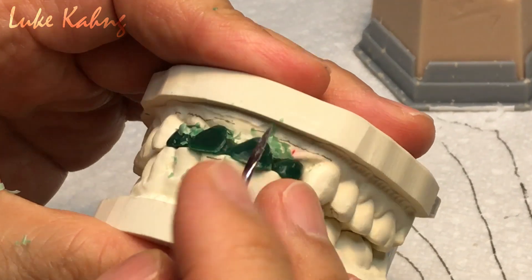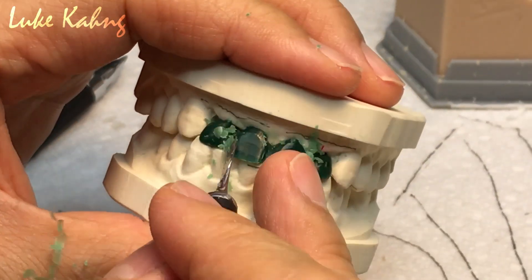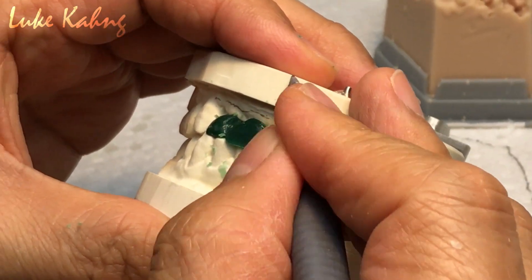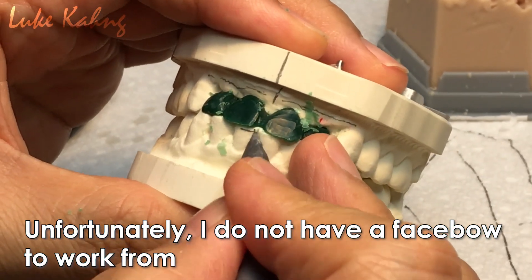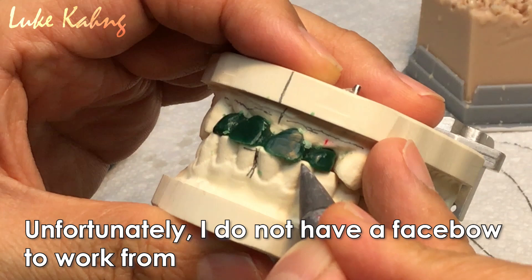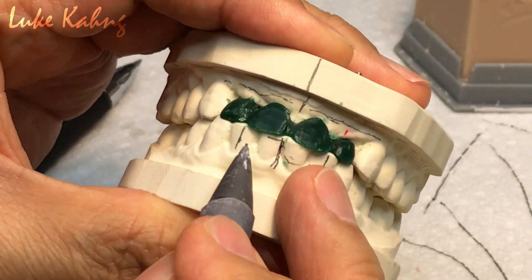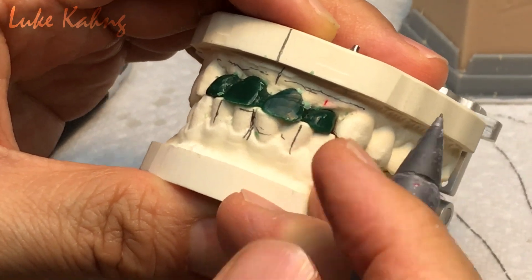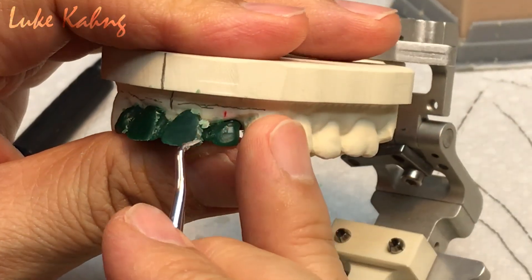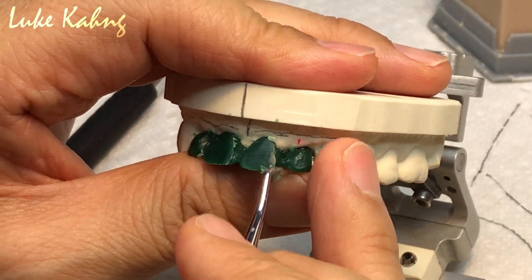Much thinner. Second, I have to write down the midline. Unfortunately, I do not have a face bow. But like I said, you have to draw. Now it is too big, so I have to move here — meaning I have to cut it this much. Make sense? Yeah, right.